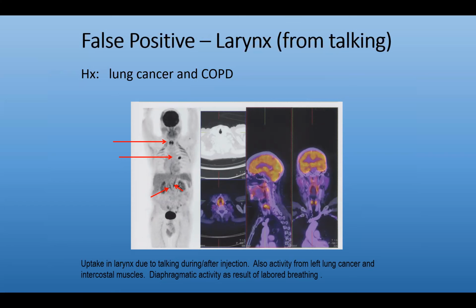Just to note that this patient also has activity due to they had lung cancer and COPD. So there's diaphragmatic activity as well. And this was thought to be due to labored breathing.